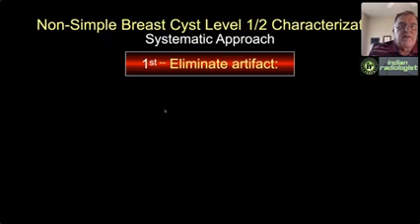Now, we have to have a systematic approach because there are just so many cysts. We don't want to biopsy any of them if we can avoid it, and we certainly don't want to put a lot of them in follow-up because it'll just plug up our system.